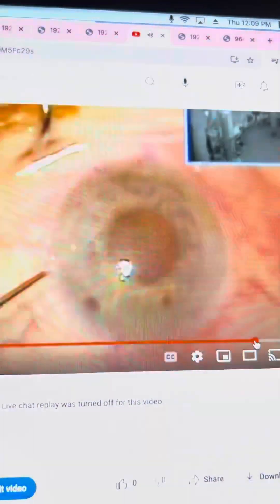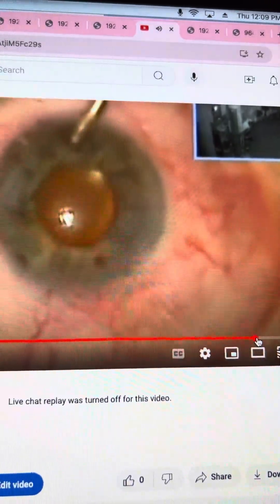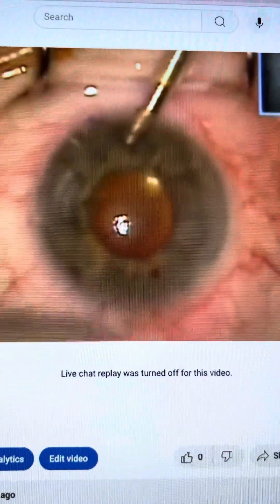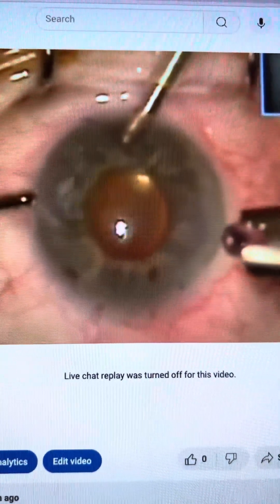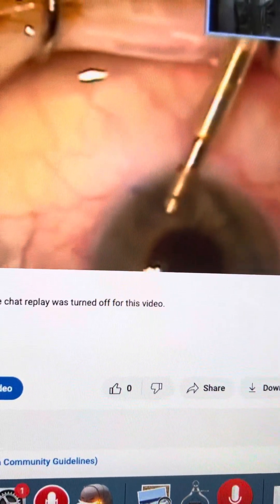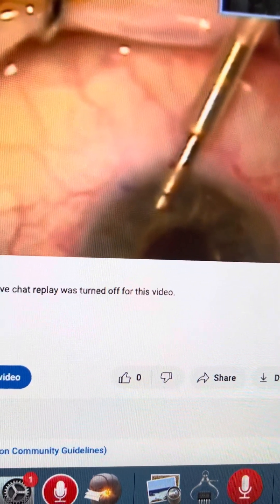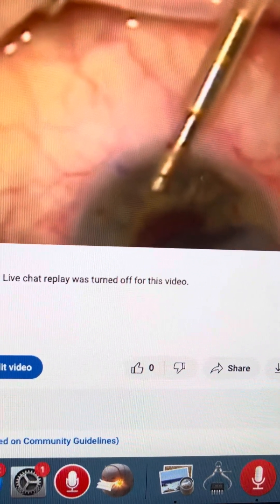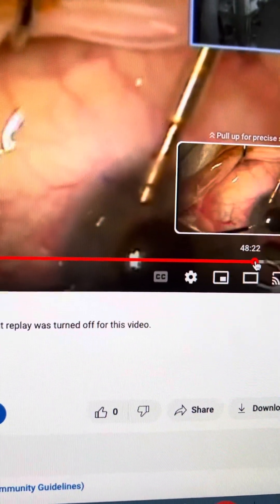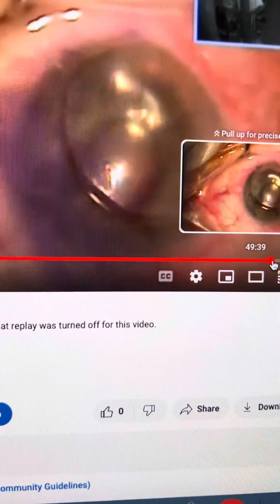We're going to place the endothelial graft in place. This is the magic moment of endothelial keratoplasty, and I'm so happy. So many years after my first transplant in 1993 at the Northport VA, under the direction of my then mentor and now friend Eric Donnenfeld, I put my first corneal sutures in a penetrating graft. Now we have the ability to do an endothelial graft. We're going in with the retina forceps to grasp the graft, coming in with a spatula. The endothelial graft is pulled in, the DSAEK graft placed in position, and then bubbled in place — tapping with the back side of our Weck-Cel sponge.